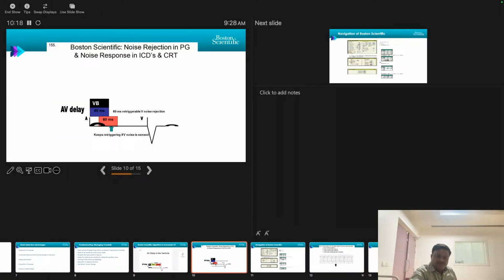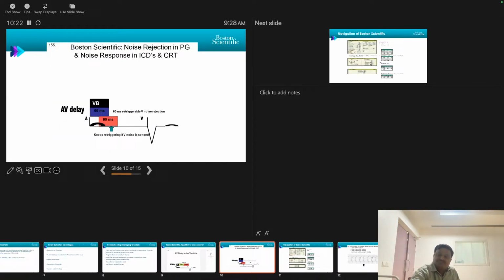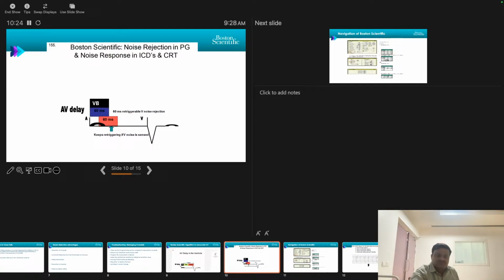So for example, in the red color, if you look, after 60 milliseconds, if something comes, it is a kind of noise. If you closely look at the noise kind of EGM, the noise will always be persistent and continuous, so the refractory period will keep on increasing.